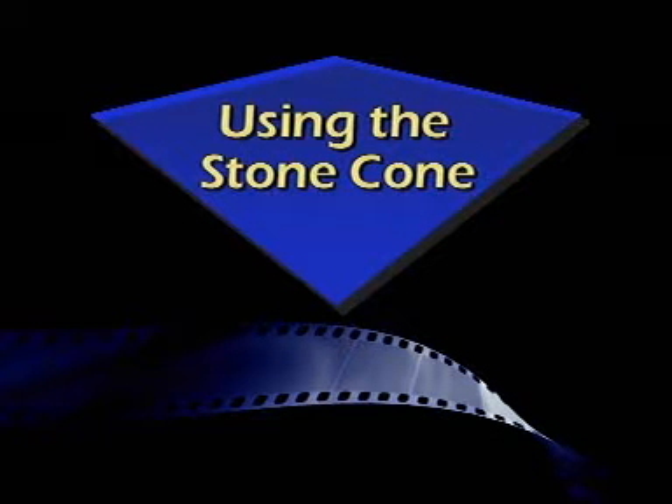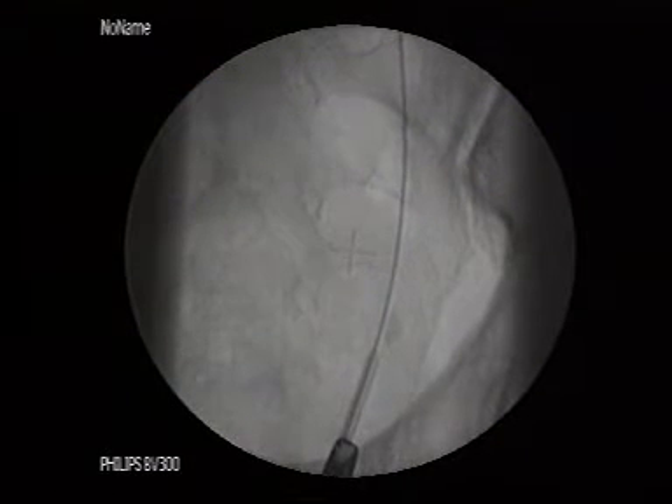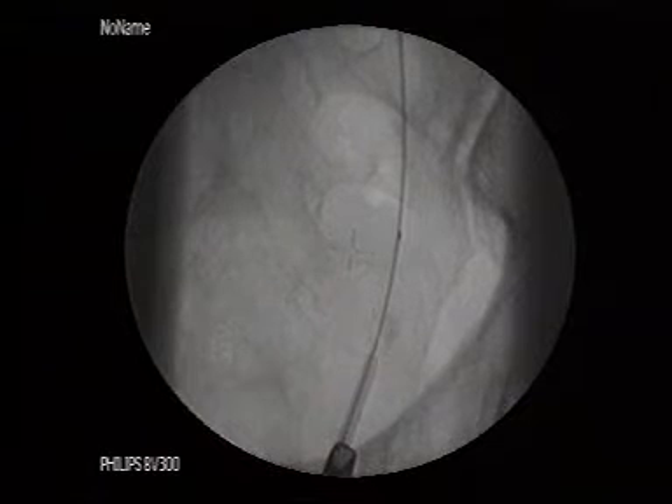Using the stone cone. The stone cone can be placed with a cystoscope and a dual-lumen catheter, as shown here. Notice the safety guide wire. The stone cone is deployed above the stone.